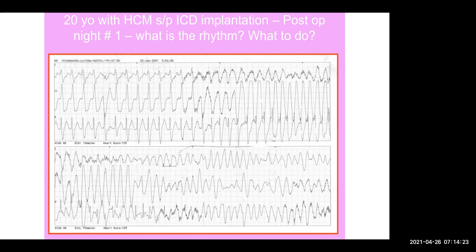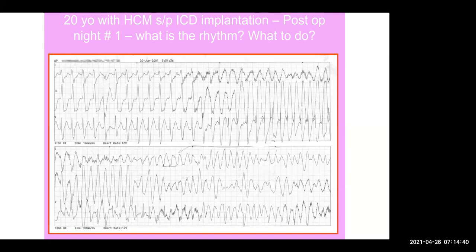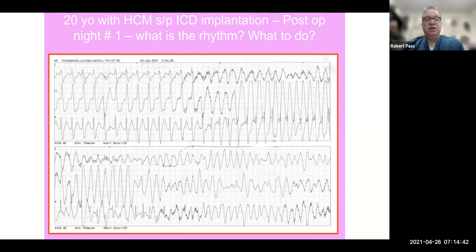If, while putting the generator back in, the lead kinked. Right, you could injure the lead during a generator change. And in fact, we always tell patients that there is a risk that we could injure the lead. That's one of our biggest concerns. There are really two concerns when you do a generator change: injuring the leads and infection. Those are always our big two concerns.